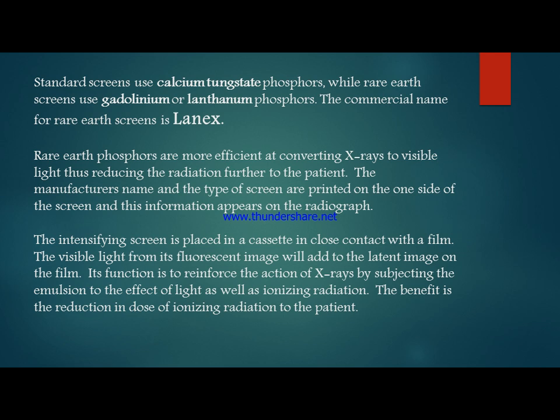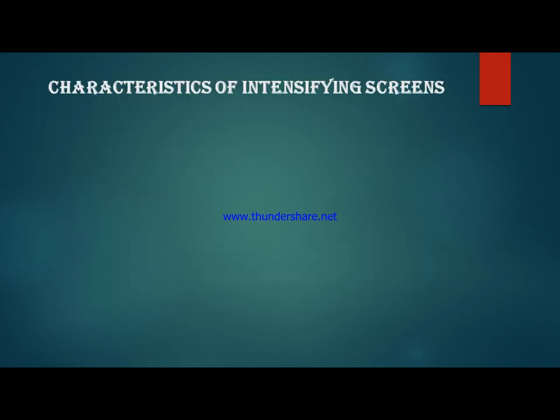and the visible light from the fluorescent image will be added to the latent image on the film, and it acts to reinforce the action of X-rays by subjecting the emulsion to the effect of light as well as ionizing radiation. The benefit is dose reduction in ionizing radiation to the patient.